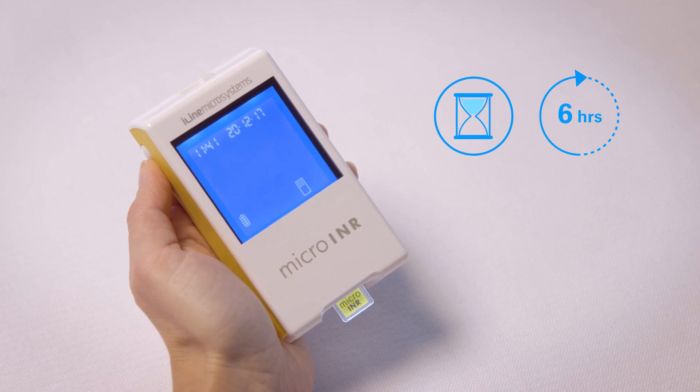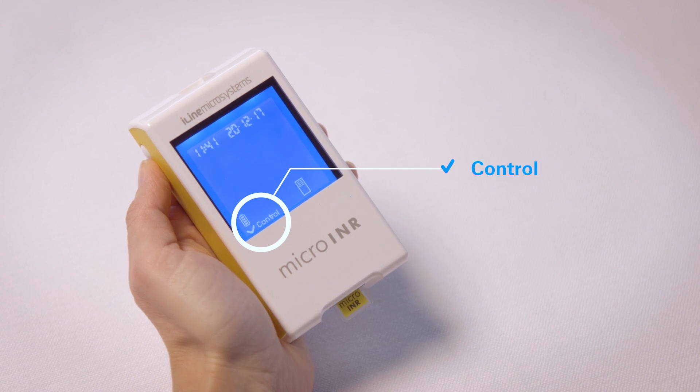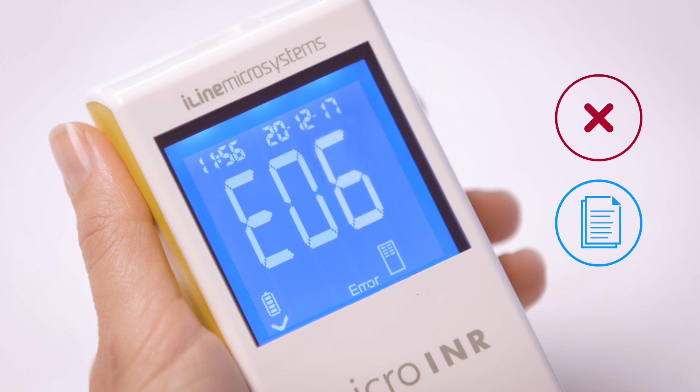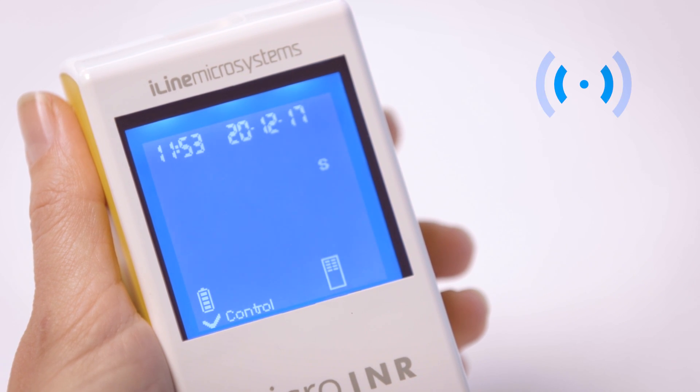The control symbol appears after the internal quality control has been passed successfully. If the internal quality control fails, you will get an error message. Please consult your manual. When the meter is ready for use, you will hear a beep signal. The display will count down from 80 seconds.